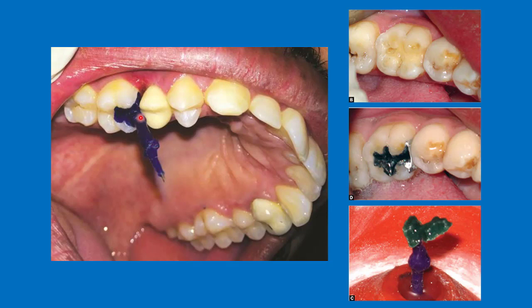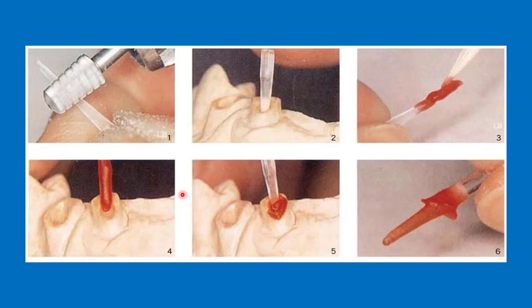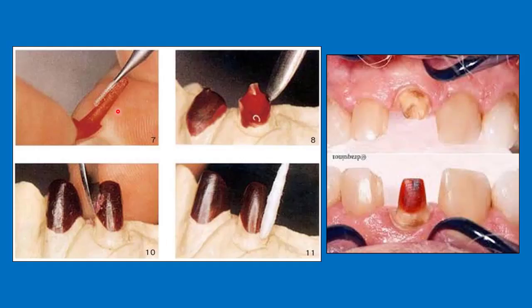Here, we have done waxing to form an inlay. In order to do a wax pattern for a post crown, a piece of plastic such as a plastic post is adapted inside the canal after preparation. We check that the post sits inside the canal. Then, increments of hot wax are applied on the tip of the plastic post and inserted quickly inside the canal. This is repeated until gaining the final result. Minor corrections may be done, then we place it inside the canal and place wax on top of it to form the core of the post and core restoration.